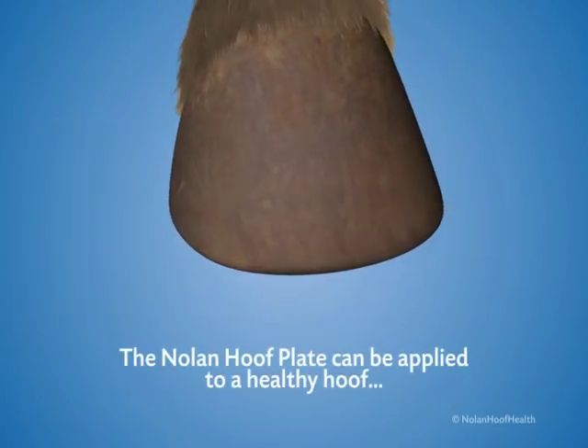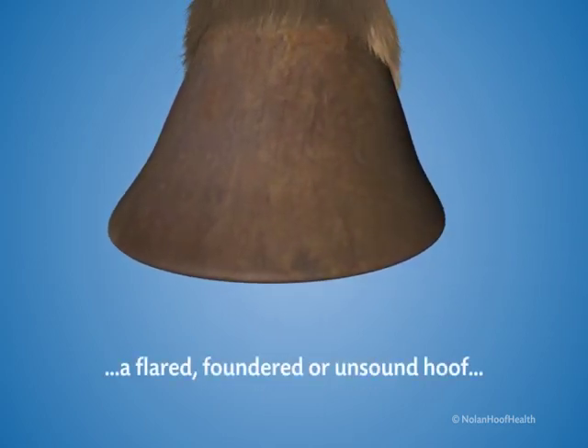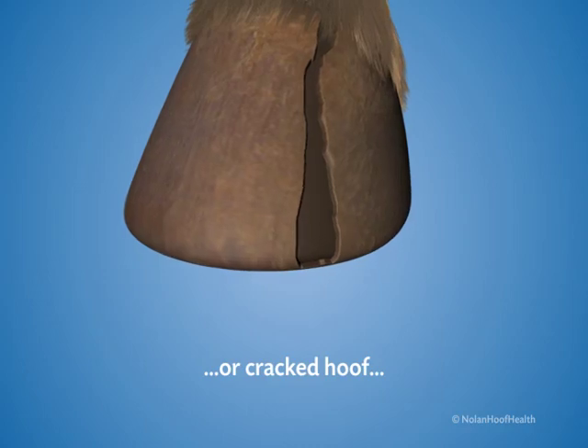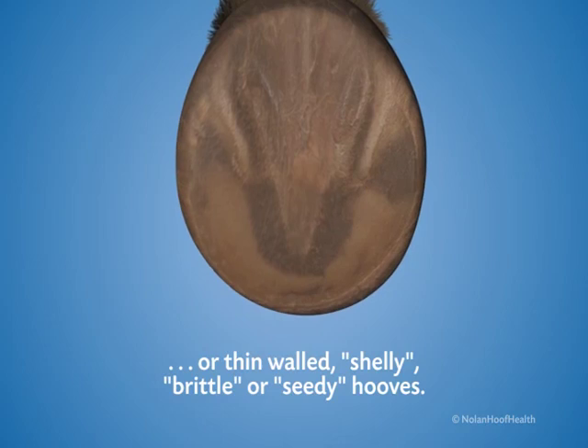The Nolan hoof plate can be applied to a healthy hoof, a flared, foundered, or unsound hoof, cracked hoof, or thin-walled, shelly, brittle, seedy hooves, or hooves with thin soles.